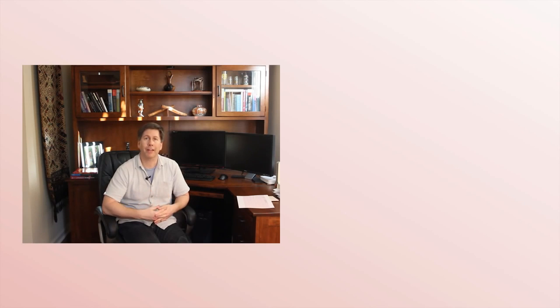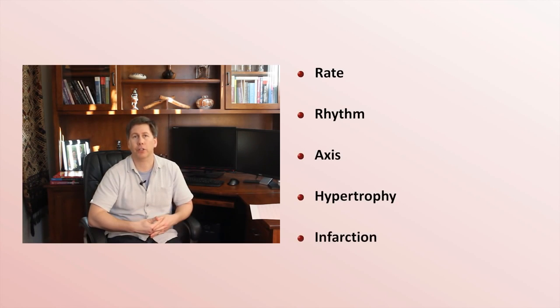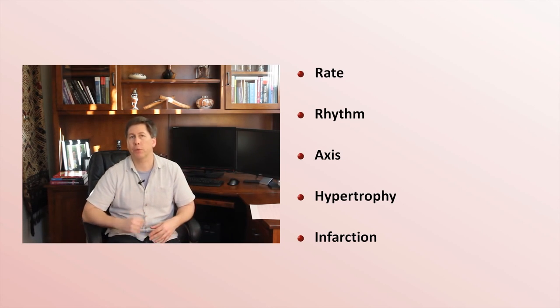So what approach do I recommend? Well, if you're a typical medical, nursing, PA, or paramedic student who has had any prior exposure to EKGs, you've probably heard the following sequence before: rate, rhythm, axis, hypertrophy, and infarction. This specific series of words gets repeated in medical school and hospital rounds so often it feels like a mantra. Have you ever wondered where it comes from? I'm not positive of the origin of this approach, but I am sure of why it's become so ubiquitous.